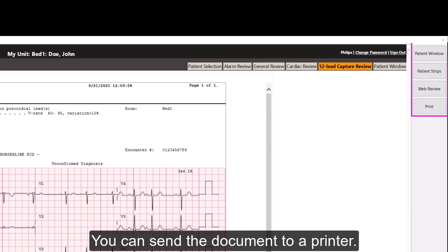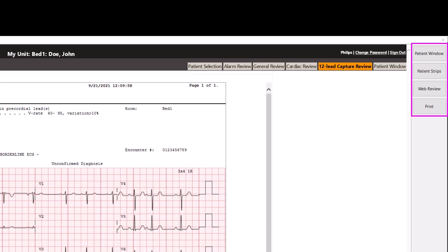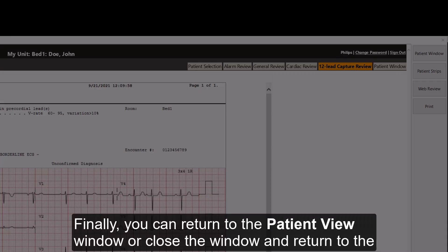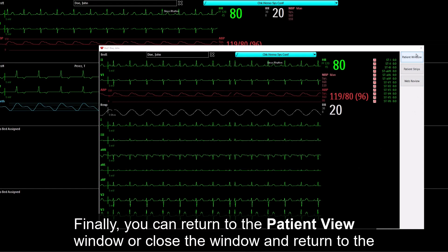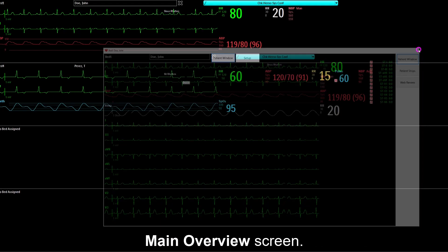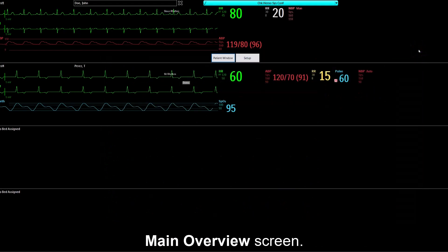You can send the document to a printer. Finally, you can return to the Patient View window, or close the window and return to the Main Overview screen.